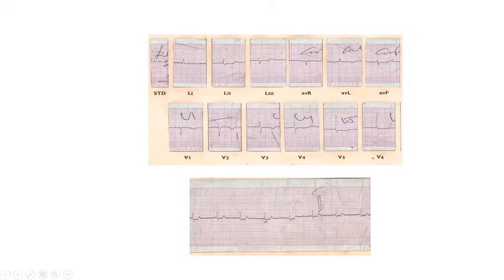Is it a nodal rhythm? No, there is a P wave here. Another P wave is seen just before the T, sir. Yeah, this is an ectopic P wave. And what is happening to that P wave? It is not conducting, it's a non-conducting P wave. The patient is having blocked atrial ectopics. Every beat is followed by an early atrial ectopic beat, which is getting blocked.